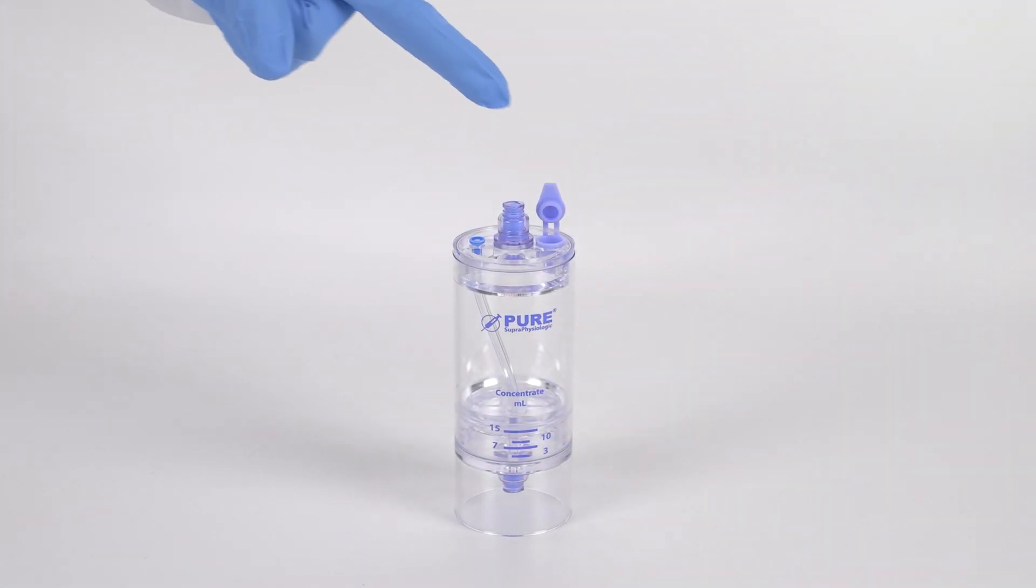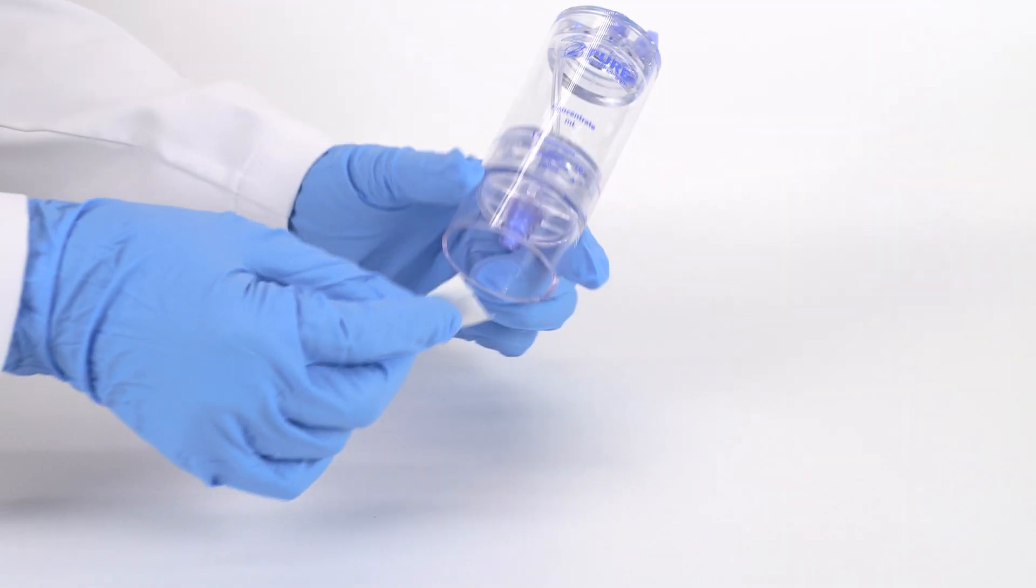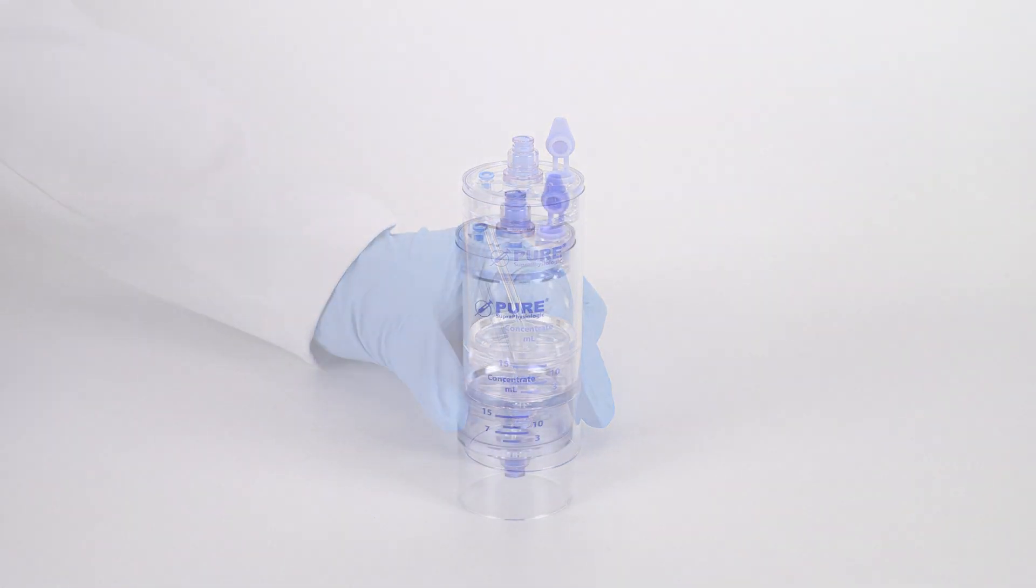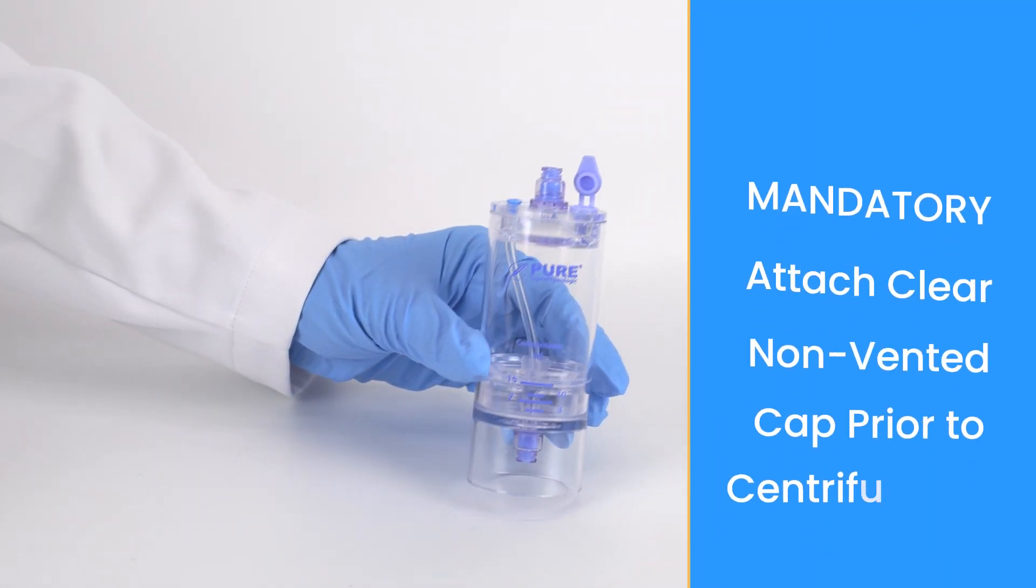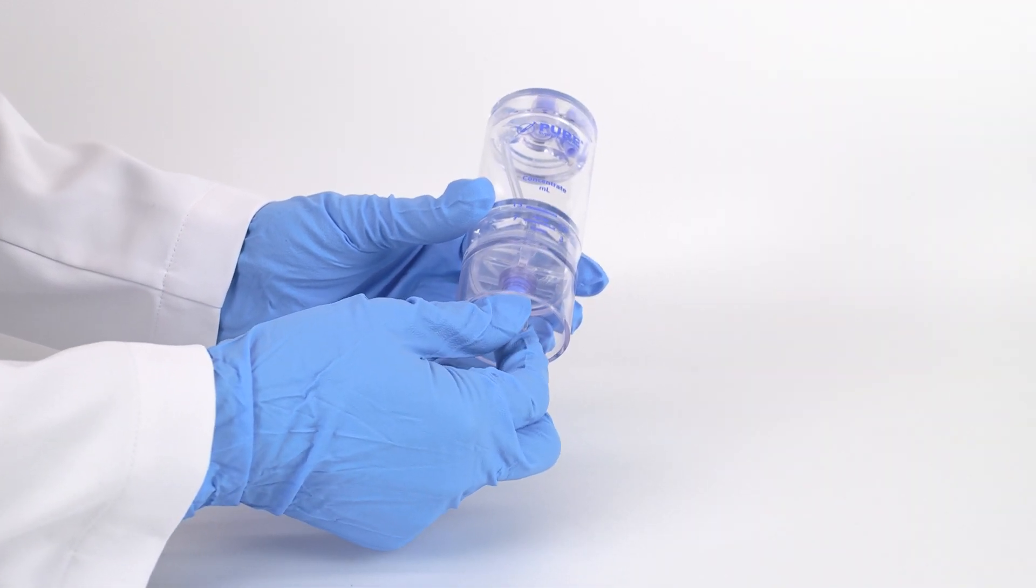To begin, make sure the vent lid is in the open position. Swab the needleless ports with sterile alcohol before and after accessing with a sterile syringe or cap. As a mandatory step, always attach the clear non-vented cap to the bottom port prior to centrifugation.